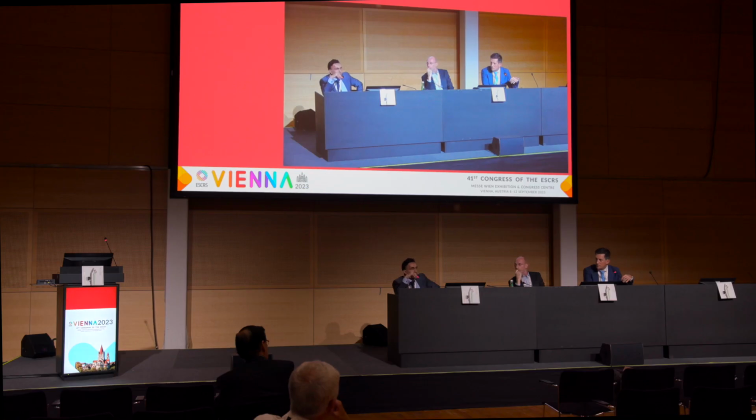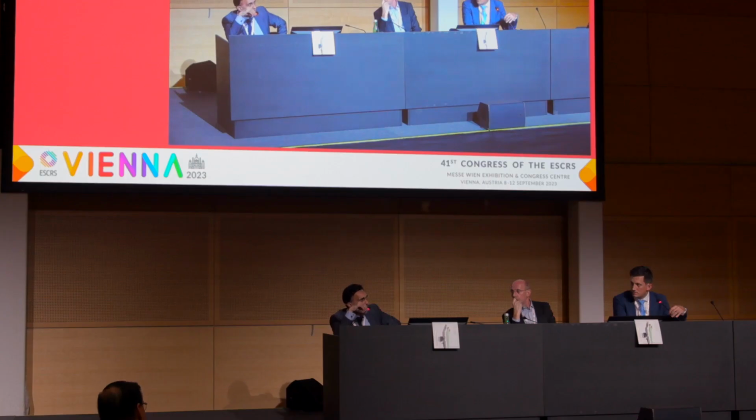Okay. And is there any level of, maybe, angle alpha that you'd think is too much, with where the lens will then center, so that you may want to think about not using this kind of lens, or have you started looking at that data? You mean the amount of decentration? Yeah.